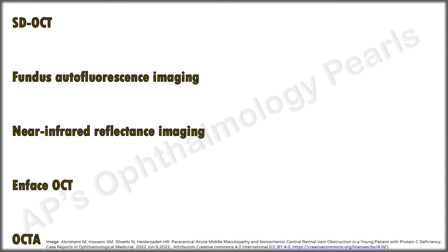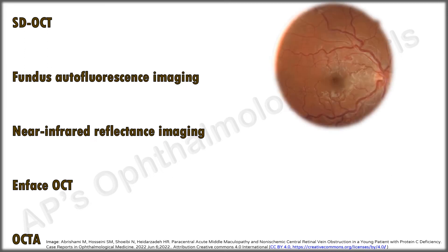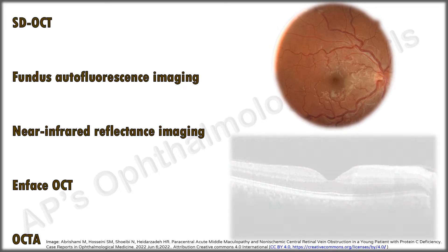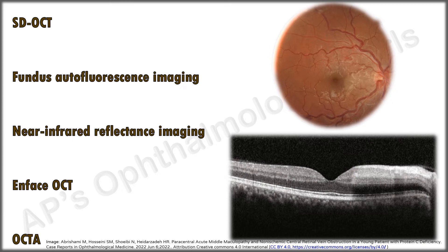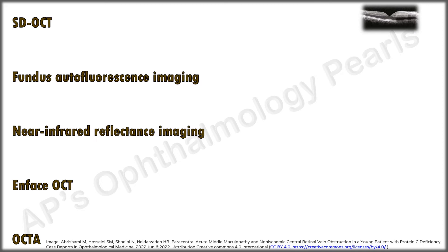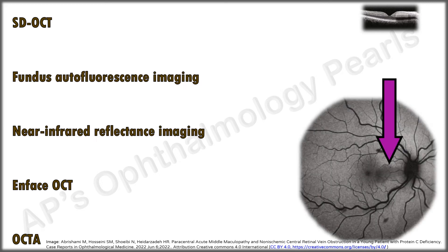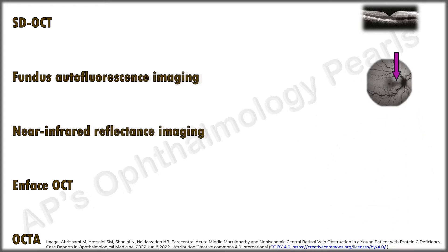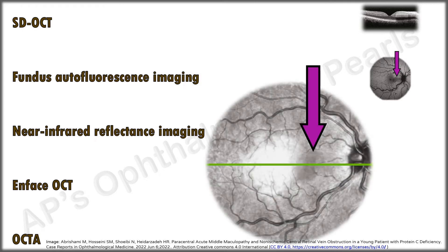These are the various modalities to detect PAM. This is the fundus of a young male with non-ischemic CRVO. There is a subtle greyish lesion in the region of the papillomacular bundle, but this can be easily missed. This is the OCT picture showing PAM. The autofluorescence imaging shows a hypofluorescent region. Near-infrared reflectance imaging shows a greyish region with sharp borders in the papillomacular bundle.